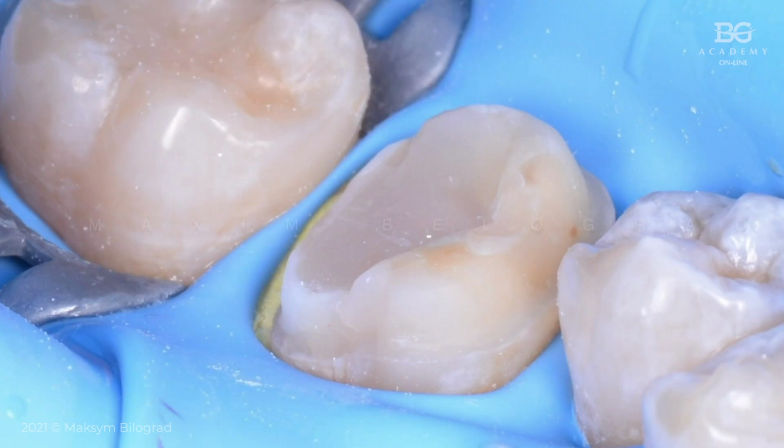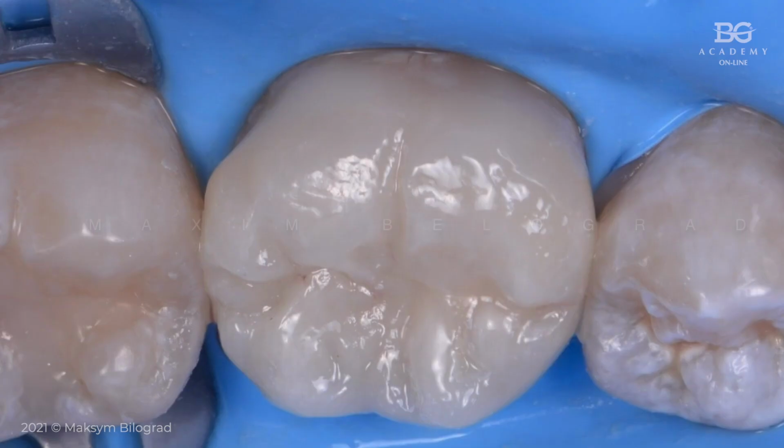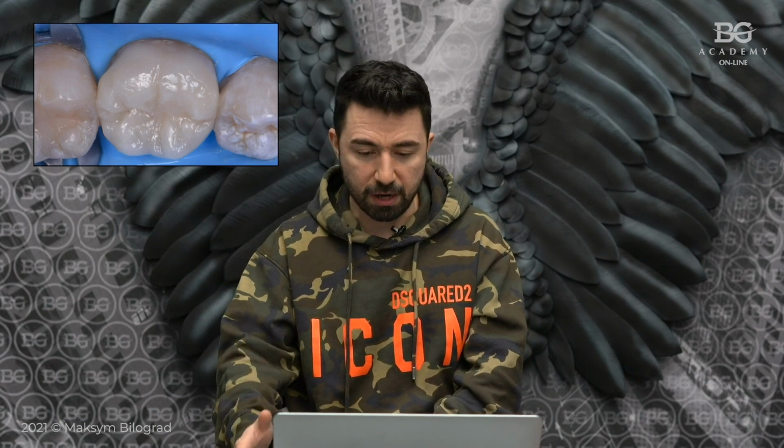So you can see here the process of cementation of the final restoration. We did isolation, we sandblast, we provide the bonding protocol, and we bonded our ceramic overlay after that endodontic treatment. So the case from A to Z with a sequence of actions as pre-endo, endo itself, following up, and final ceramic restoration.